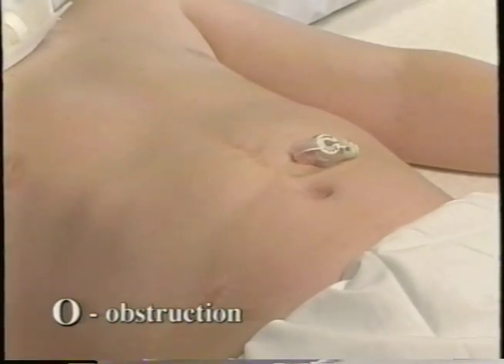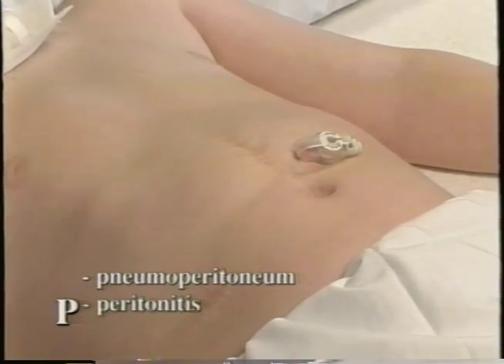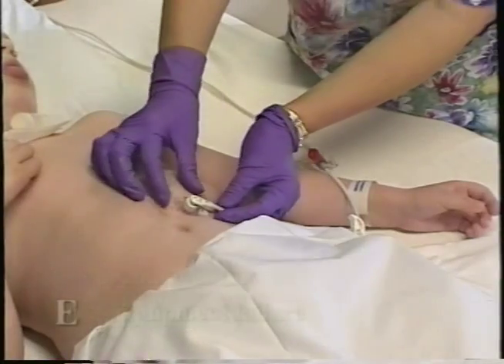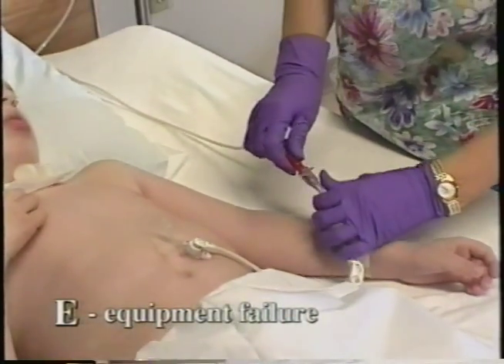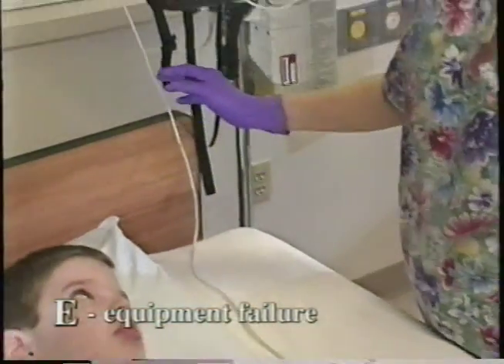In this case, P stands for pneumoperitoneum, also for peritonitis or perforation. And E is for equipment failure. Are there any connections leaking? Is the feeding tube hub cracked? Is the feeding pump failing?